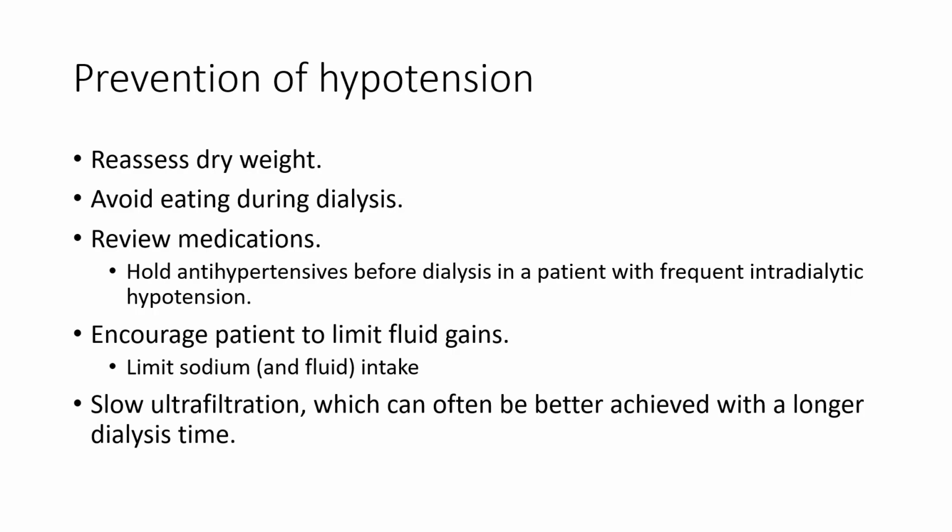Obviously, review their medications. Consider holding antihypertensives before dialysis in the patient with frequent intradialytic hypotension. Encourage the patient to limit fluid gain, so limit salt and water intake. And finally, slow down the ultrafiltration rate. This can often be better achieved with a longer dialysis duration.